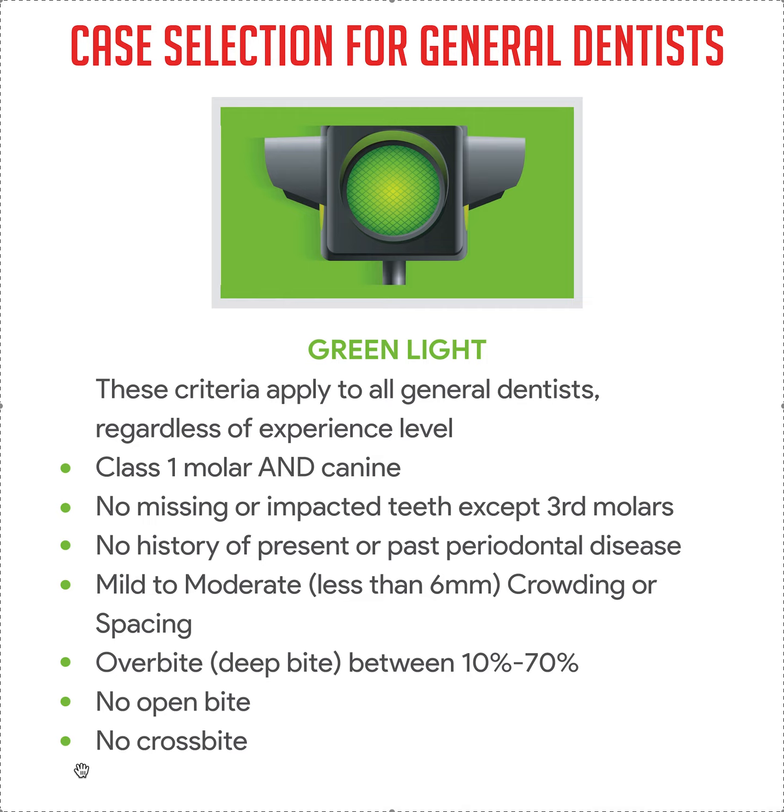So these are your green light cases. Go for it. You can do these yourself. You can probably do these with any aligner brand out there or braces. Should be super easy. There shouldn't be any complications, assuming that you treatment plan it properly. All right. So do these cases.